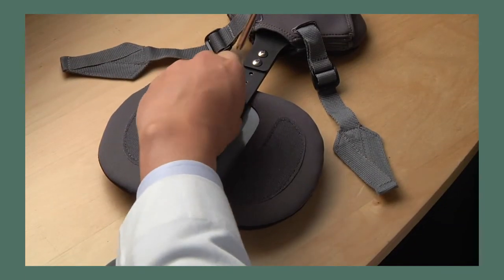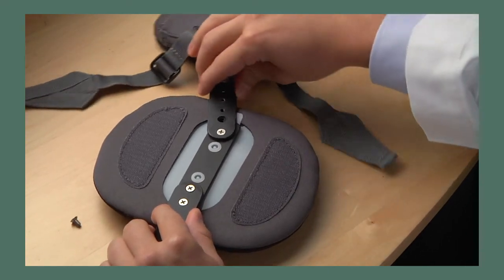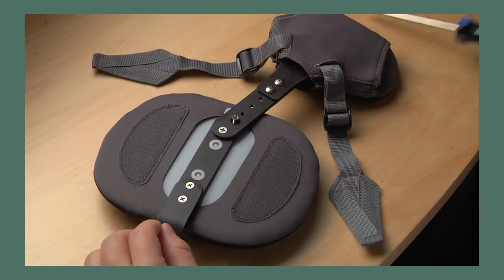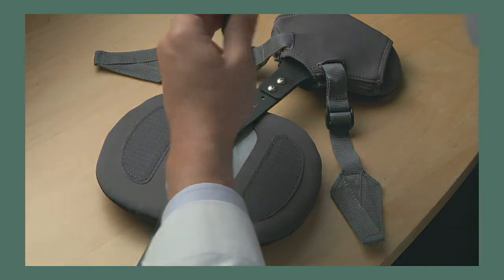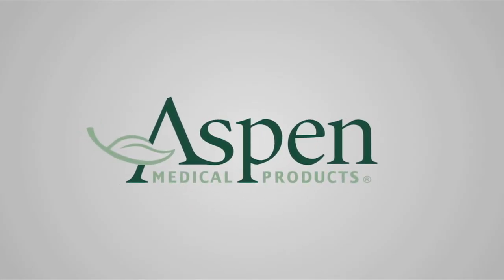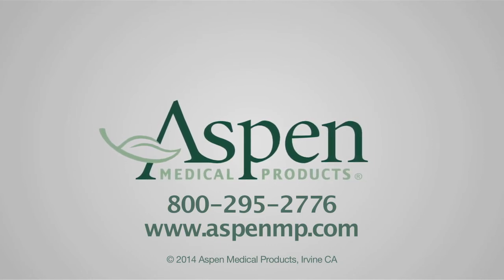For certain patients, it may be desirable to angle the thoracic pad by removing the lock screw, positioning the strut in the desired angle, and reinstalling the screw. For questions or further information about the Peak Scoliosis Bracing System, please call Aspen Medical Products at 800-295-2776 or visit us online at www.aspenmp.com.